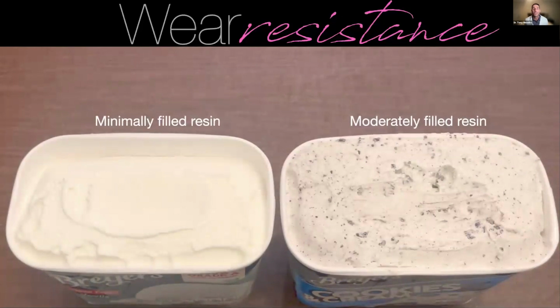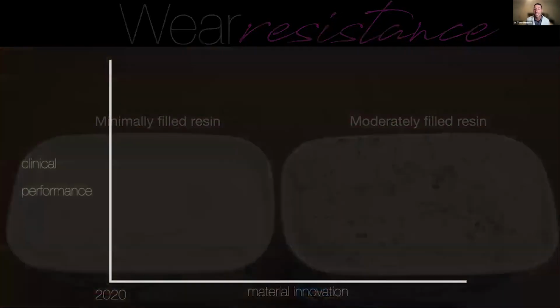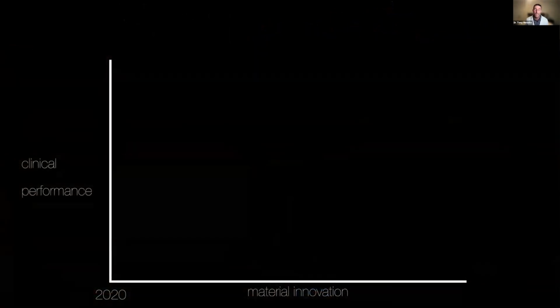Okay, so what do I mean by this? Well, the printed resins that I've placed into patients' mouths for numerous different indications, I've seen a lot of wear with these materials, so much more than I would see even in a direct composite. So that's the take-home message of my ice cream demo. And by the way, the ice cream was delicious, just so you know.